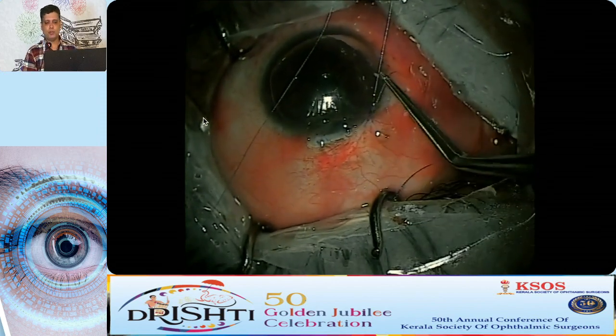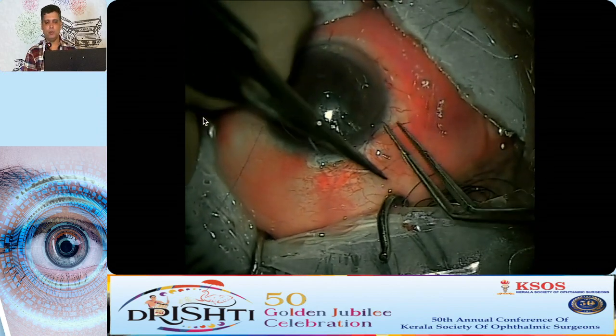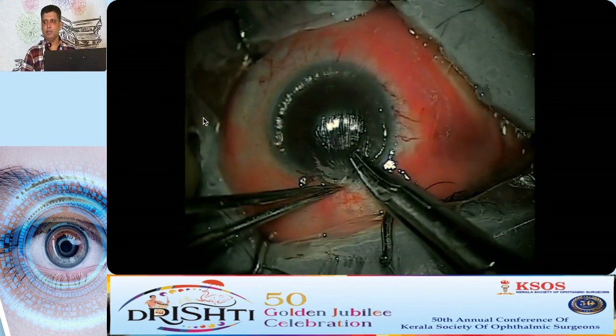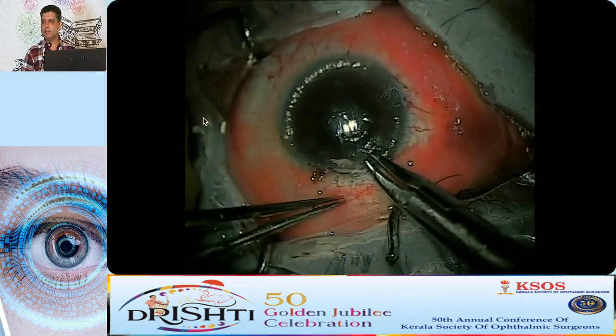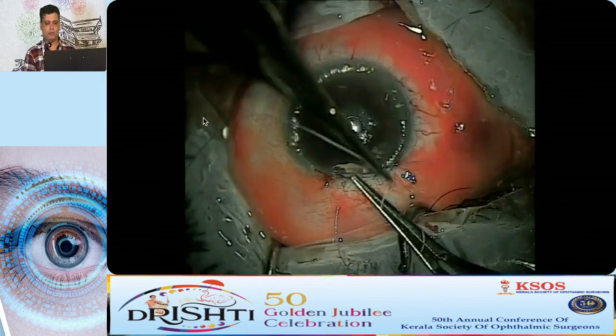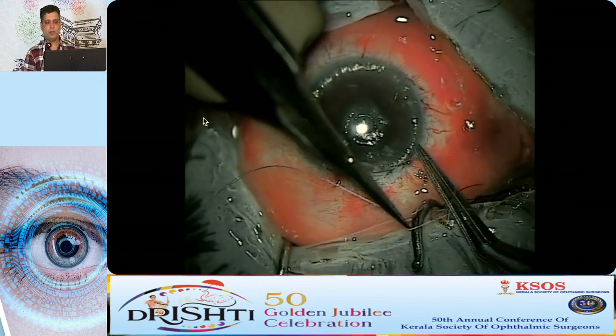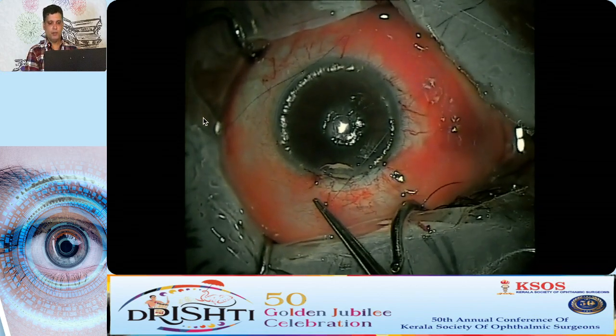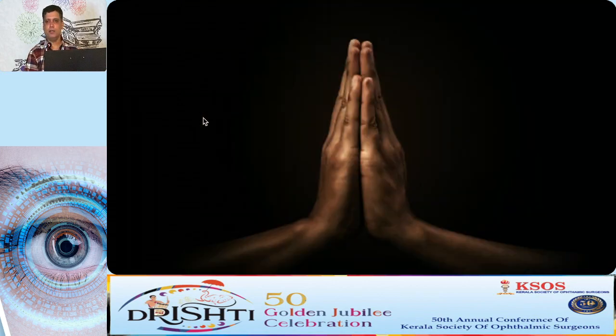Whether you want to use 10-0 nylon or 8-0 Vicryl is again left up to you, but Vicryl tends to leave a little more inflammatory changes, especially in the early post-op phase, but it's absorbable. That is the advantage. So once you do all this, a small prayer and thank you. That is optional.